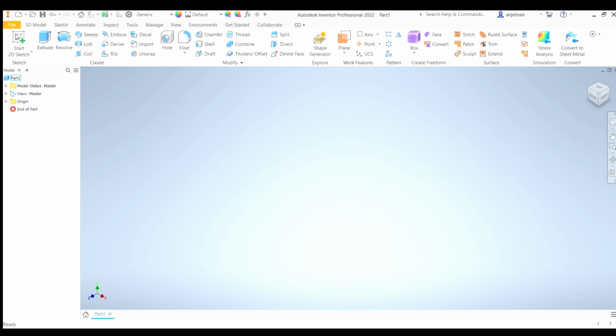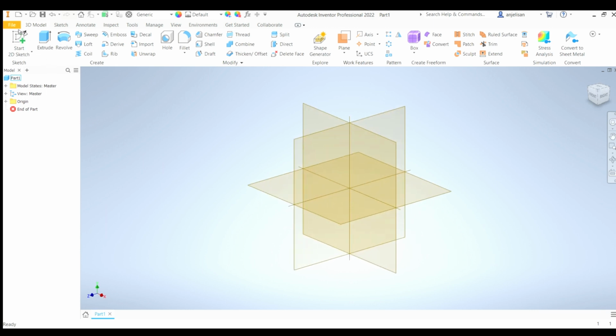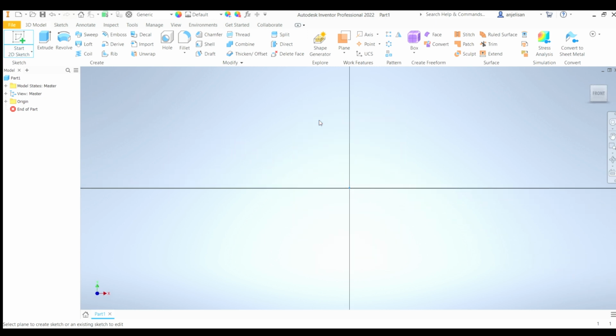So first off, we want to start a 2D sketch. Well, before that, you probably haven't opened Inventor yet, or maybe you have, but now you need to open up a part file. So sometimes after clicking new, it'll pop up this window. You just make sure that it's in English units, since that's what we're working with, and then you double click on standard IPT. Alright, so anyways, with that out of the way, you'll be able to open up this, and after starting a 2D sketch, click on the XY plane.